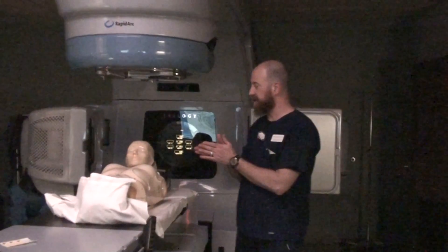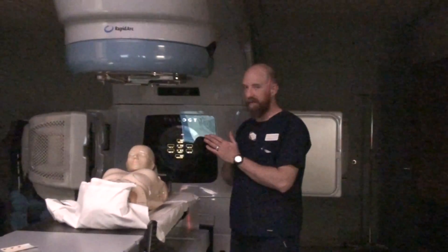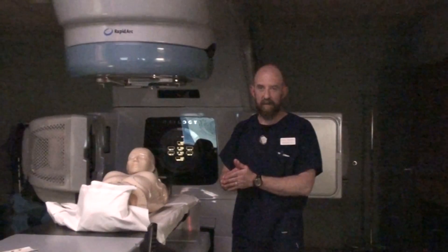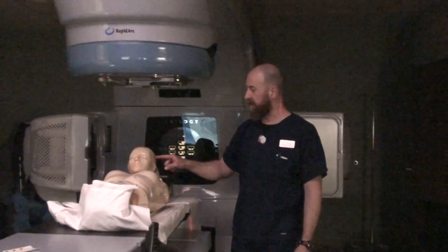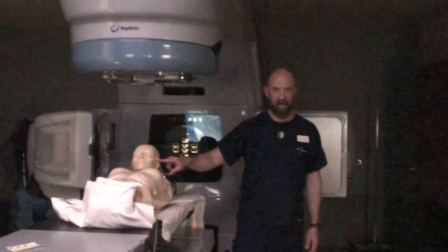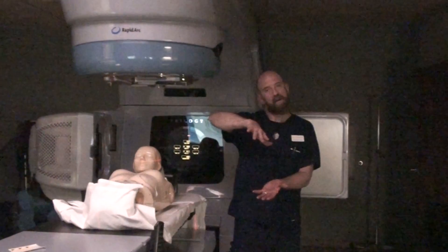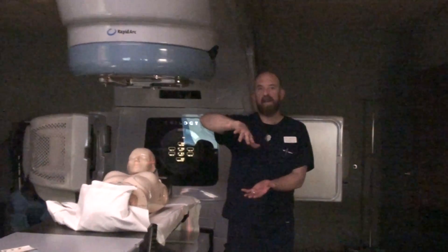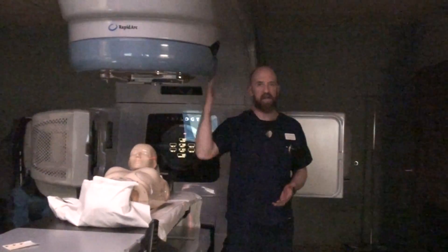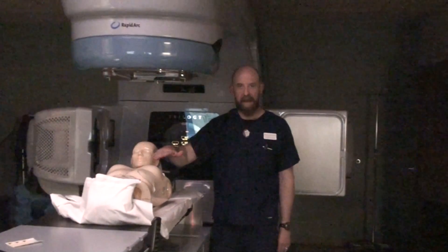The doctor is going to then move the fluoro themselves. Once the position has been decided and everything is good, you're going to come back in the room and you're going to mark your CR. The gantry is still on your lateral. The next thing you want to do is rotate up to the anterior.